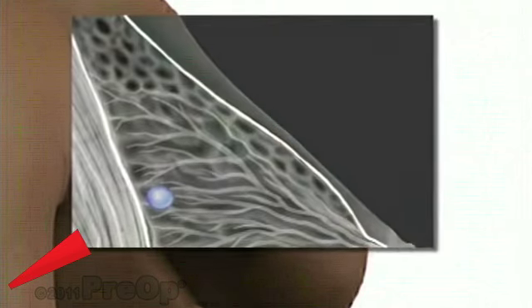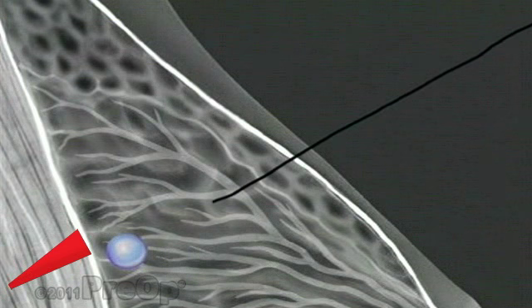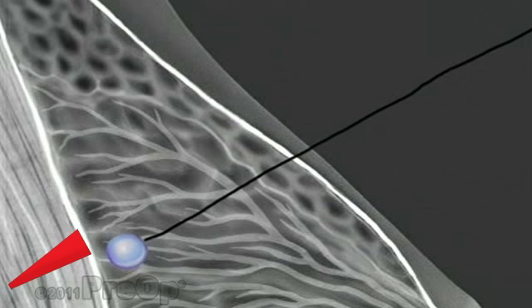Before surgery, you will be taken to a radiology lab. There, the radiologist will inject a small amount of anesthetic in order to numb your breast. Then, using your last mammogram as a guide, the radiologist will insert a thin wire into your breast, moving the end of it towards the area of abnormality. This wire will serve as a pointer for the surgeon during your operation.